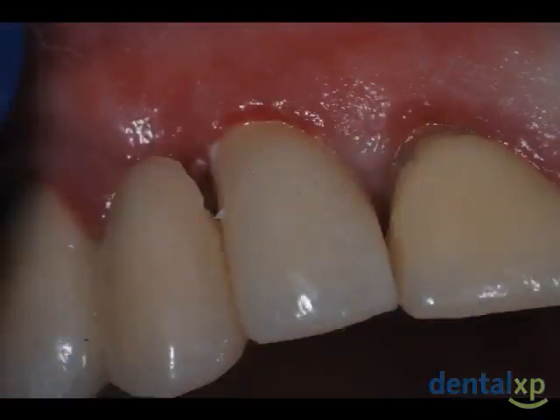Permanent cement is placed in the implant crown and the putty analog is placed into the crown. Excess cement will extrude out at the margin and is wiped away. The final restoration is cemented with minimal cement.